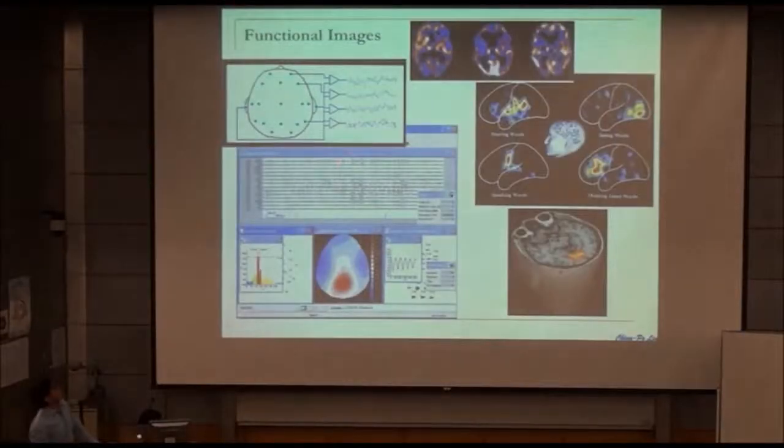And here is an example of EEG and MEG measurement. You can see that with MEG measurement, we can locate the region by some mathematical method and localize the source. But of course, in contrast to MRI, even though we can identify some regions, the spatial resolution is poor compared to MRI. However, for EEG and MEG, the temporal resolution is very high compared to MRI techniques.